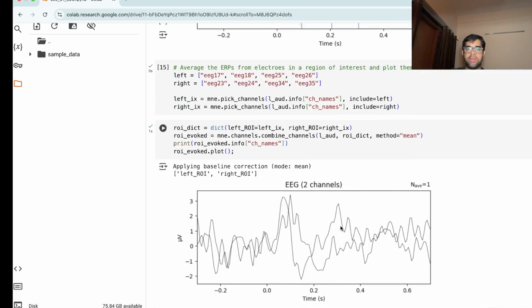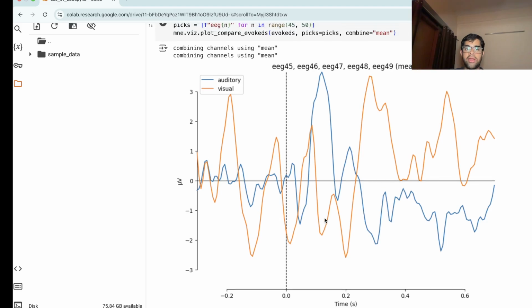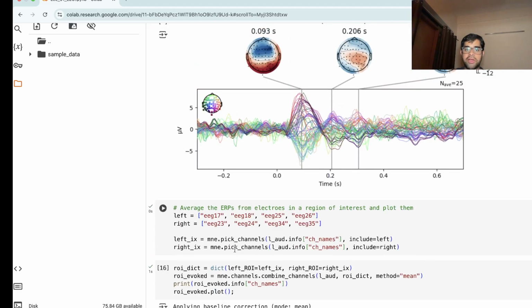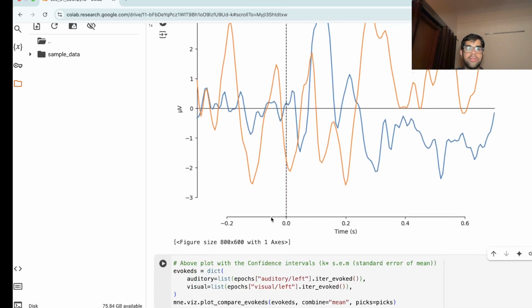And so I hope this notebook is clear. You can execute it by yourself once and get familiar with it. And if you have time, you can look into what each function does also. We'll go into each as we go through the lectures. So I've shared this notebook, you can look into this.